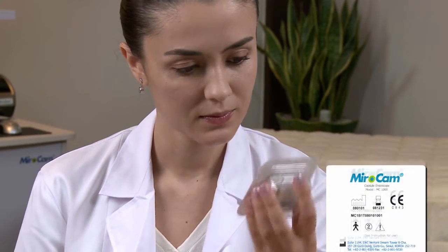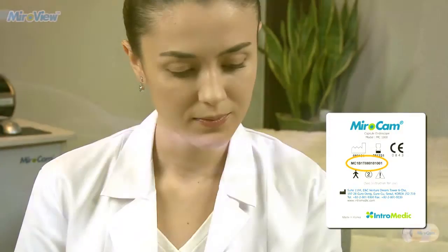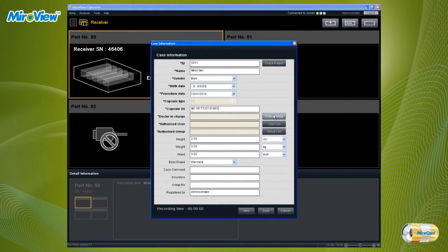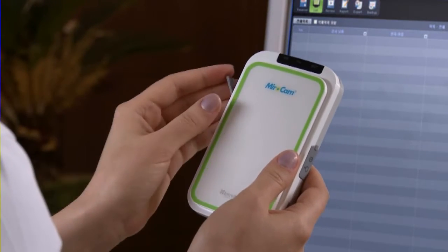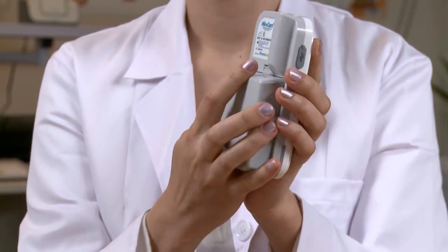The capsule serial number must be entered. The serial number can be found on the back of the capsule packaging. After entering the patient data, click the Save button. Disconnect the USB cable from the receiver and attach the fully charged battery to the receiver.